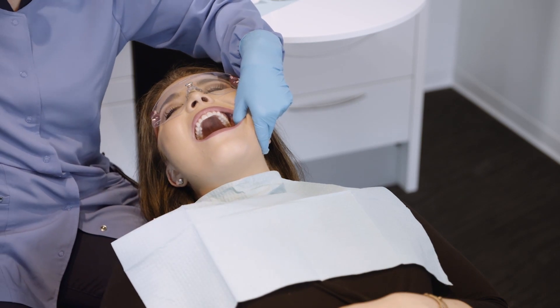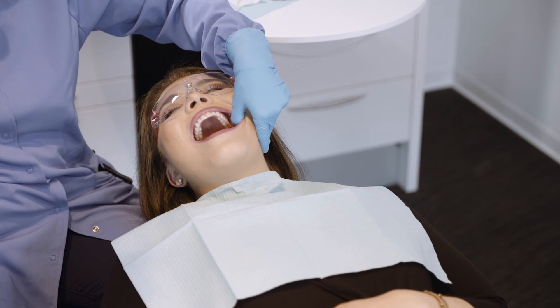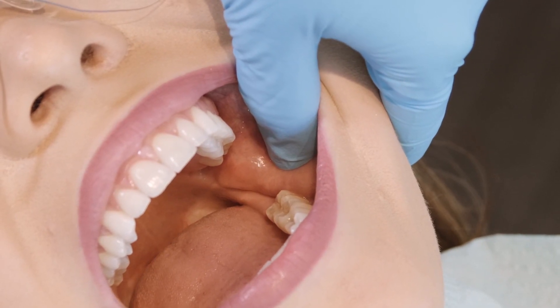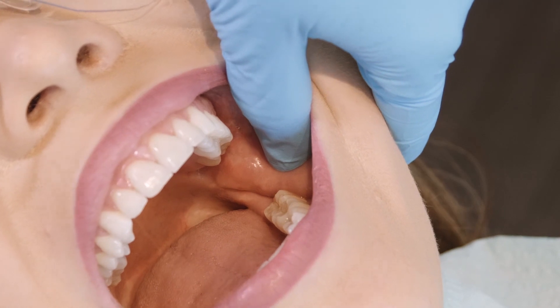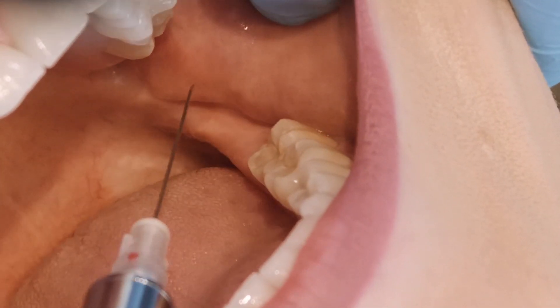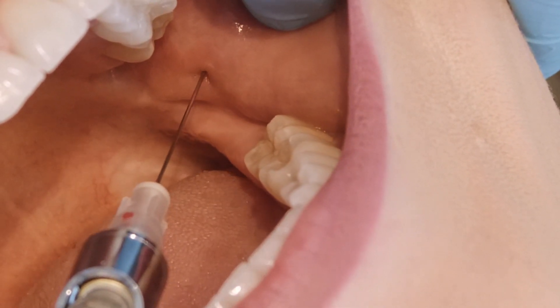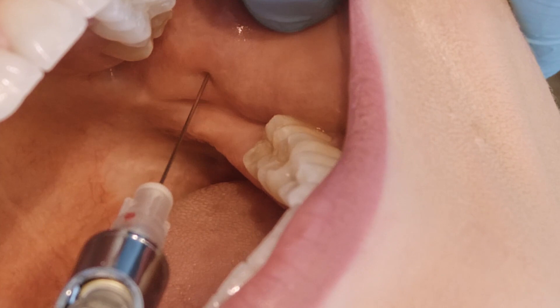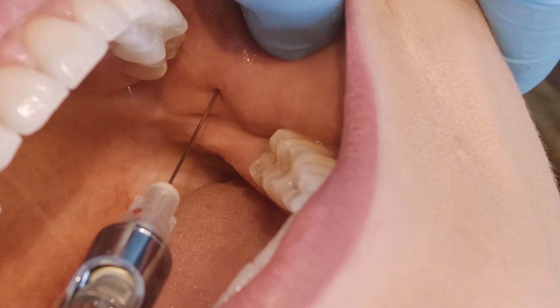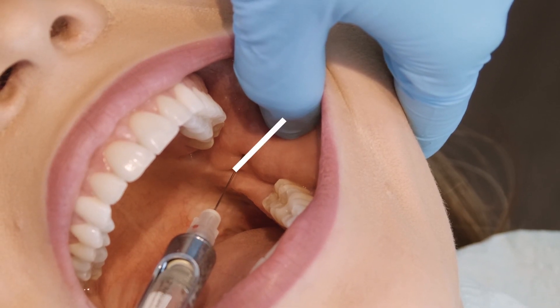With the patient's mouth wide open, the thumb is placed over the anterior border of the ramus and pulled laterally, retracting the cheek and buccal pad until it rests within the greatest depression of the coronoid notch, made parallel to the mandibular occlusal plane. With the syringe oriented over the opposite premolars, the needle is advanced to the insertion point lateral to the pterygomandibular raphe, at the height of an imaginary line bisecting the thumbnail.